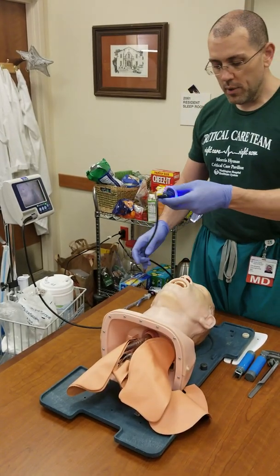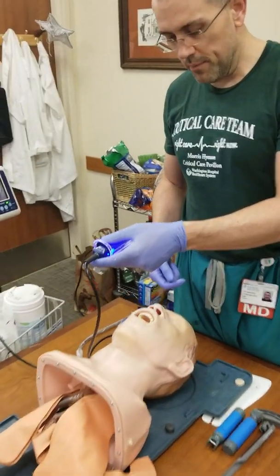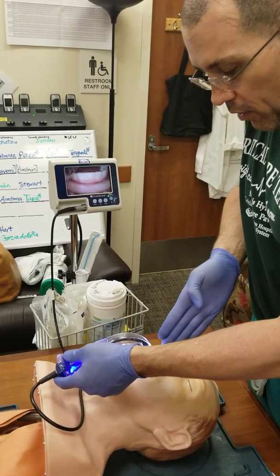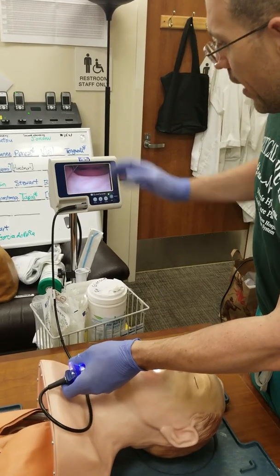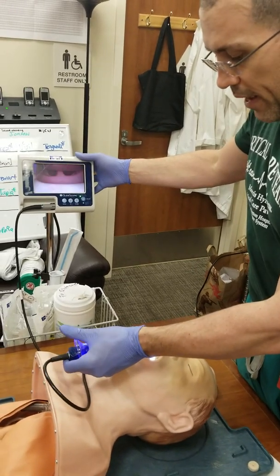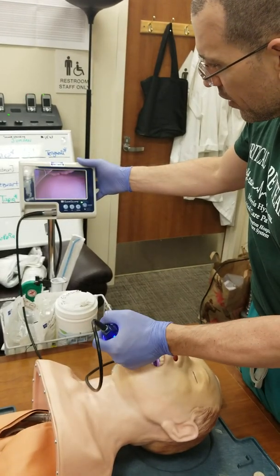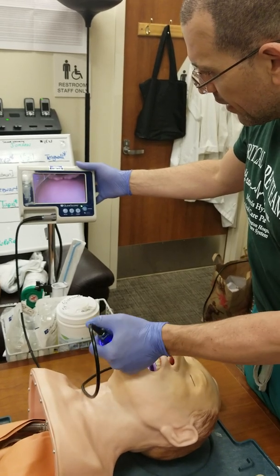With the GlideScope, the technique is to go straight back midline — right in the middle of the mouth, straight back. I look at the screen. As I go midline, I continue to push down, going in. I come right into the vallecula.